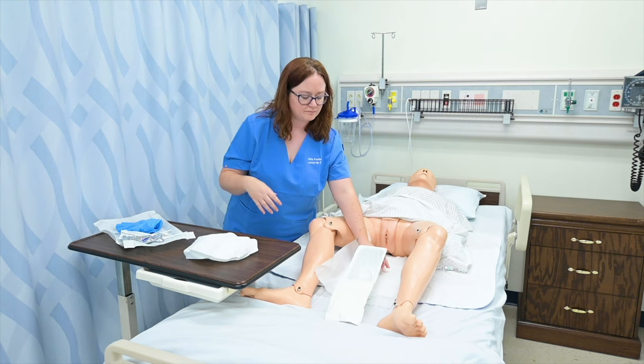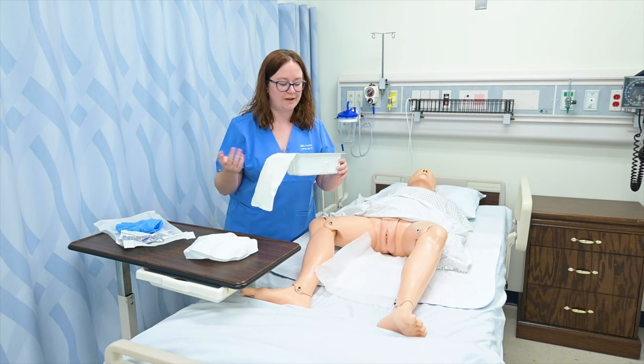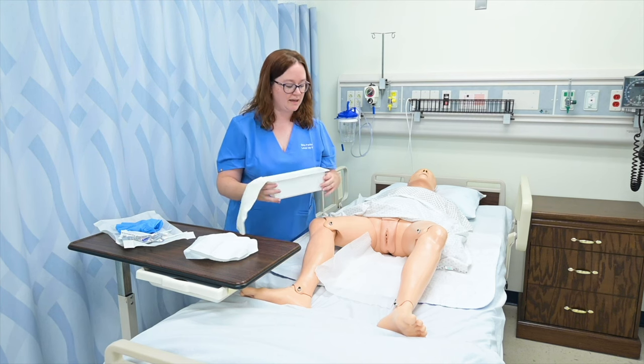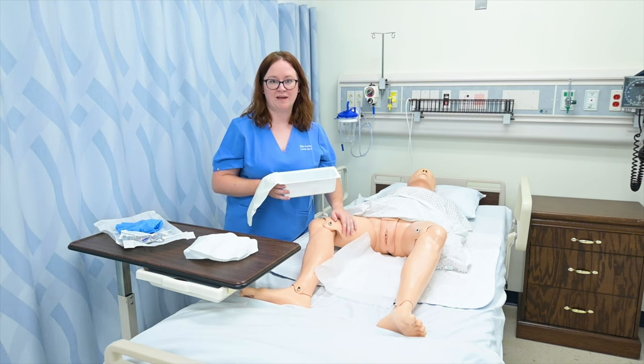And then I could either measure this on the container itself, or if I wanted to, I could pour it into something else. I could use the sterile cup, etc. And then I simply clean my patient and reposition them. And that's how I straight cath a female patient.